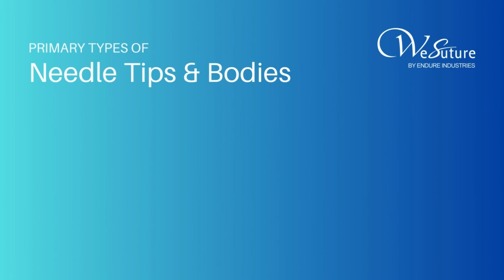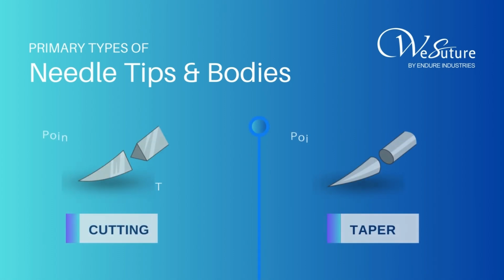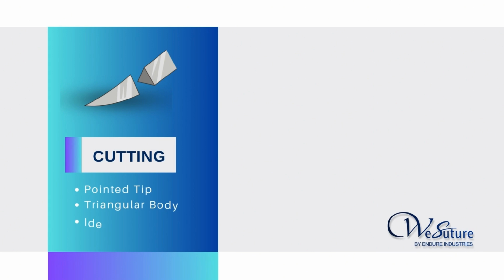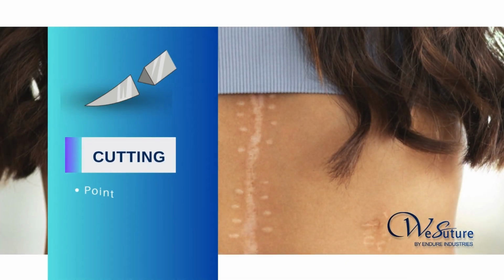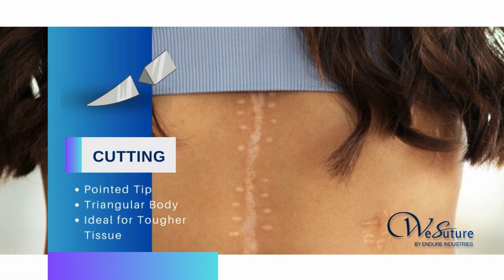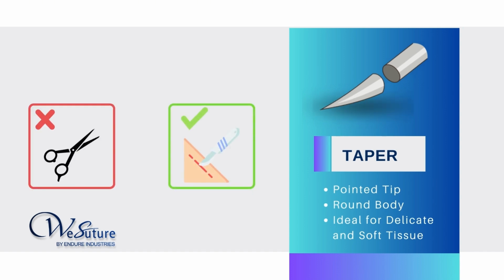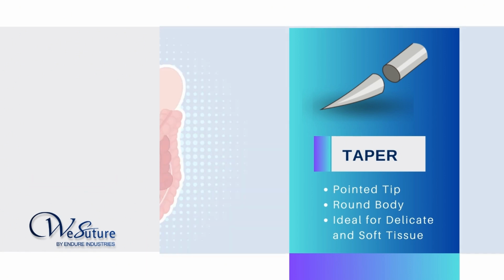Now, let's take a closer look at two primary types of needle bodies: cutting needles and taper needles. Cutting needles have a triangular body with a sharp edge along their length, making them ideal for tougher tissues such as skin. Taper needles, featuring a smooth, round body and a pointed tip, are designed to gently separate rather than cut through delicate tissues like subcutaneous layers and the gastrointestinal tract.